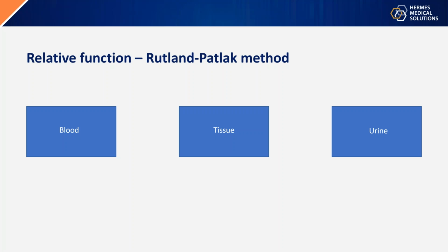We have the tissue and we have the urine. So the activity can go between these compartments with varying speeds, and these speeds are denoted by these rate constants K1, K2, and K3. The blood and the tissue can exchange activity. Once again, this is done in the top of the renal pyramids we saw earlier. And the activity can wander back and forth.